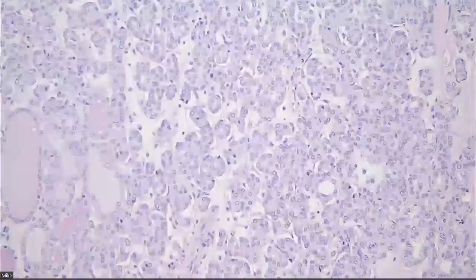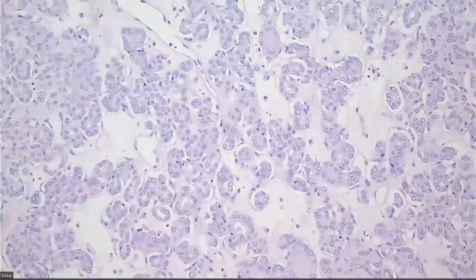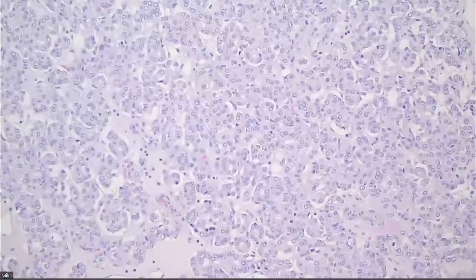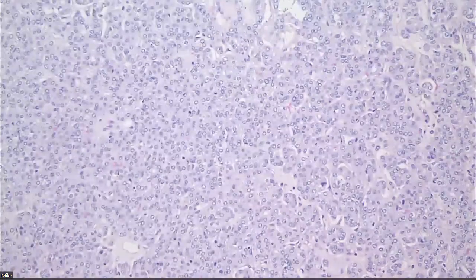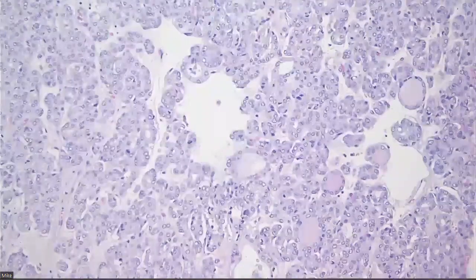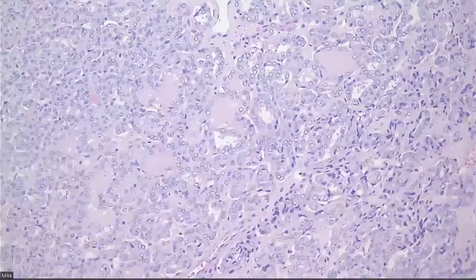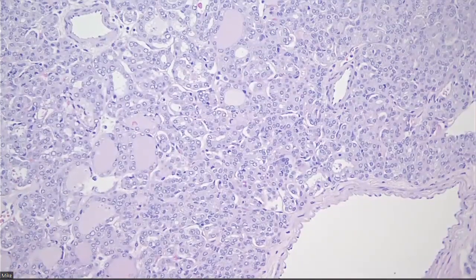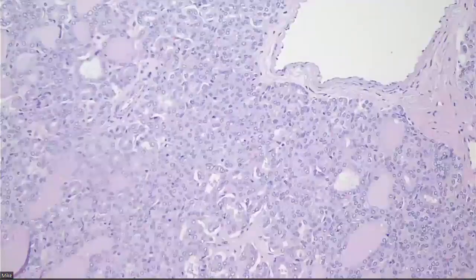So who wants to do what in this case? Ignore it, call it an adenoma, call it PTC, or do our ancillary test. Do the ancillary test. Okay, so you do your BRAF V600E and it's negative. And what?